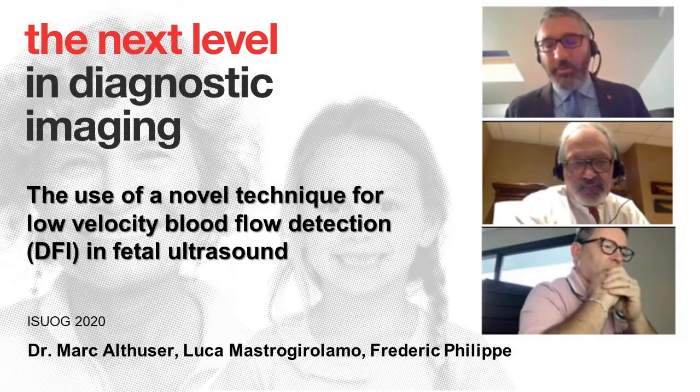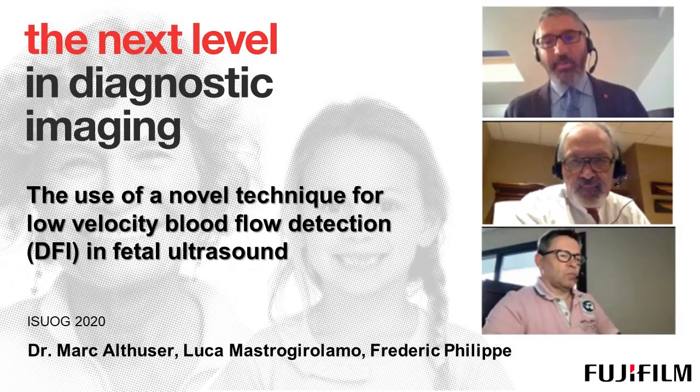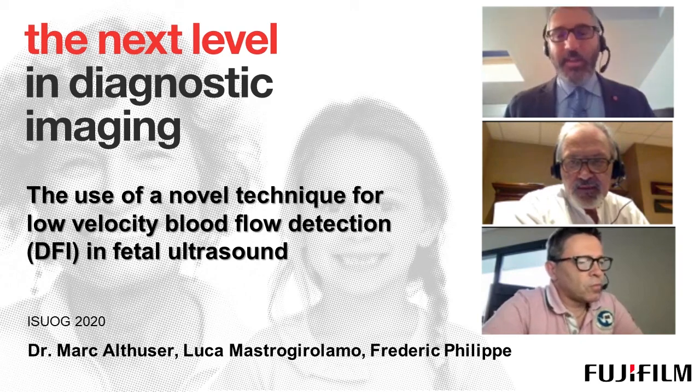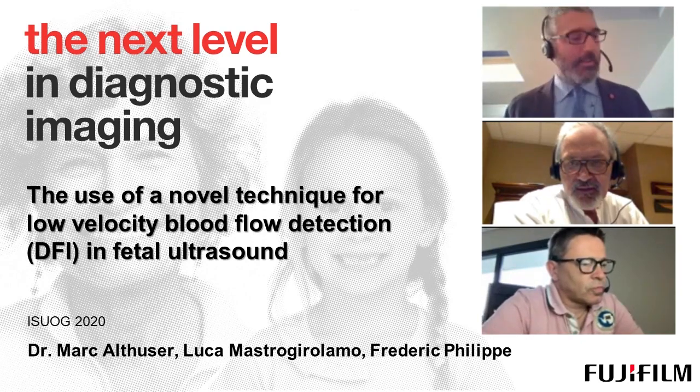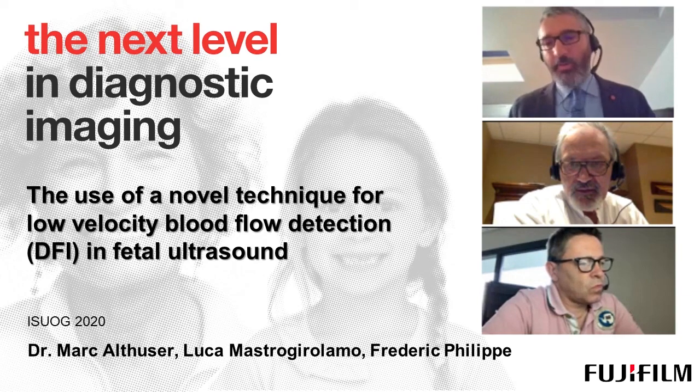So, dear Dr. Althuser, I would like to thank you very much for your very nice presentation. You presented very nice cases with beautiful images. So I think that you gave a very good extent of the possibility of the new technologies for low velocity blood vessel detection. It seems to be a very promising technique.